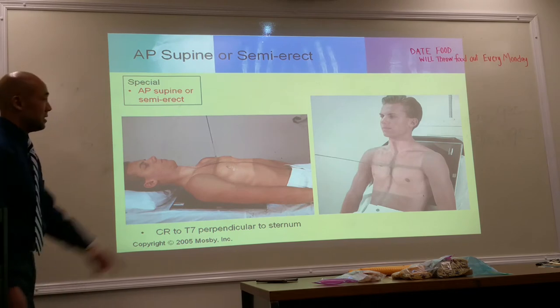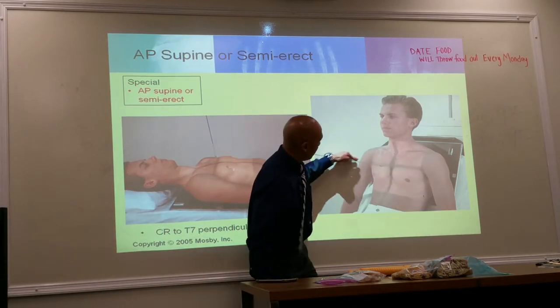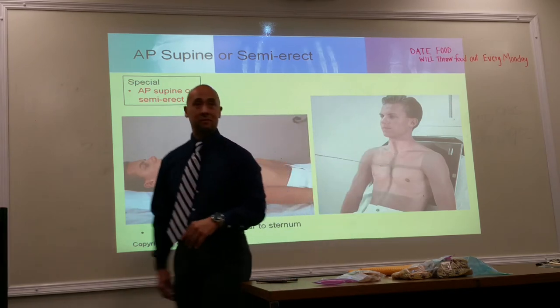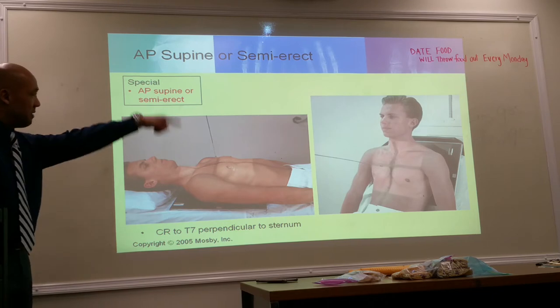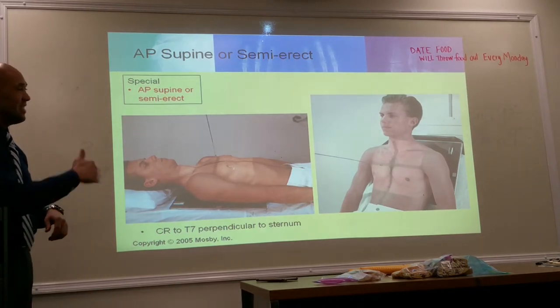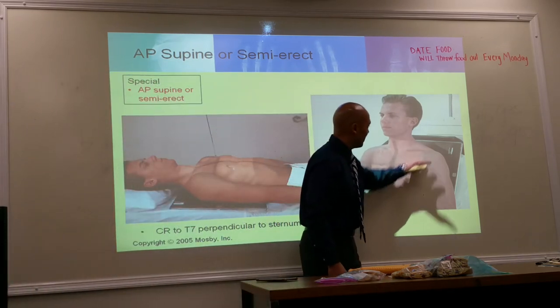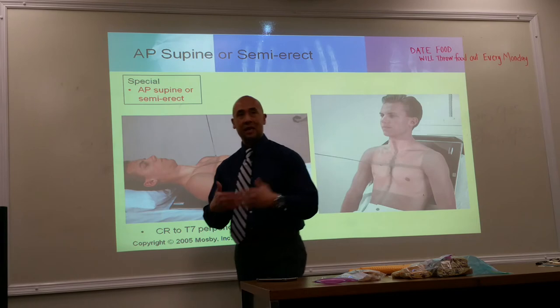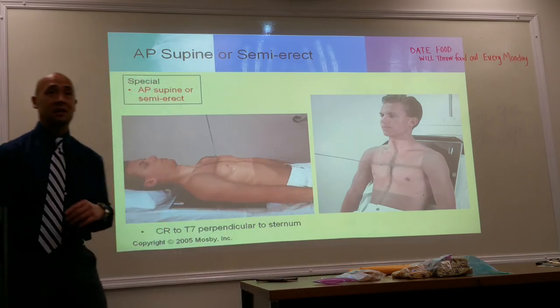Okay? Same thing over here. It's not perpendicular to the image receptor. It's perpendicular to the sternum at the level of T7. Okay? Top of the image receptor is at the level of vertebral prominence of C7. This is the best way to, again, make sure that the middle of your cassette and image receptor is at T7, by using the top border of your cassette.